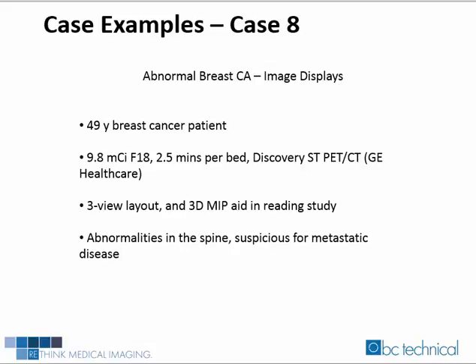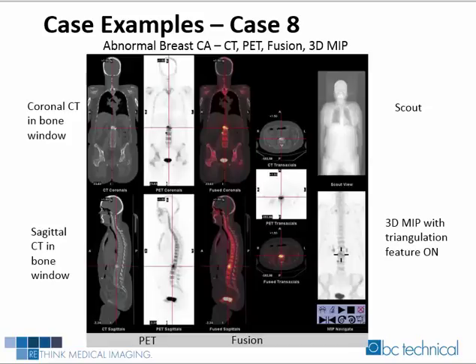Case 8 is the case of a 49-year-old breast cancer patient referred for an F-18 bone scan. The injected dose was 9.8 mCi of F-18. Approximately 45 minutes after injection, the patient was scanned using a GE Discovery ST scanner at 2.5 minutes per bed position in 2D mode. The three-plane overview with CT, PET, and fusion of the patient's torso shows abnormal uptake in the spine. The 3D MIP in the lower right also provides a triangulated view of this area of interest.